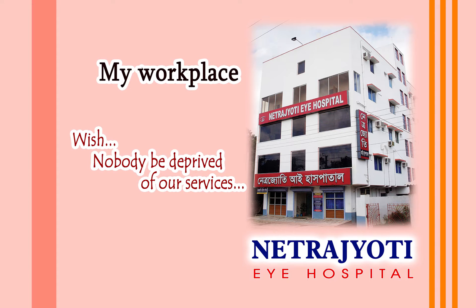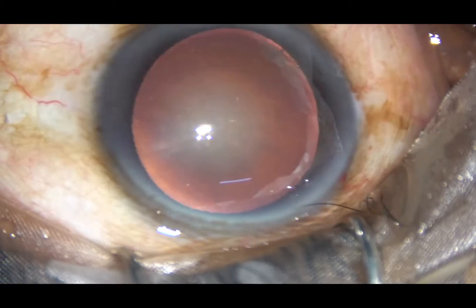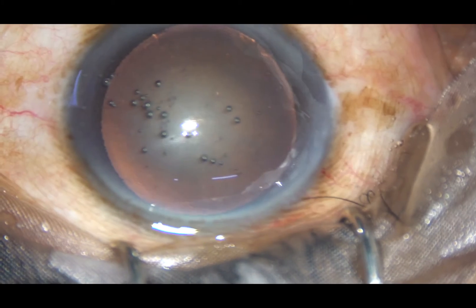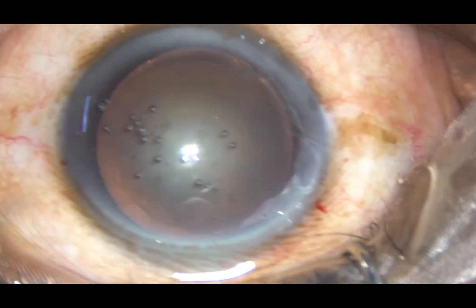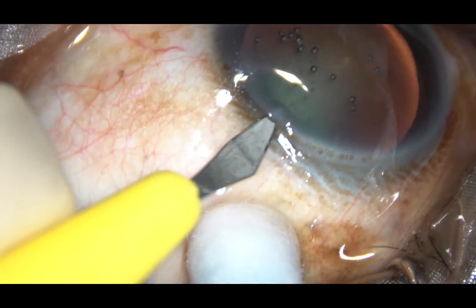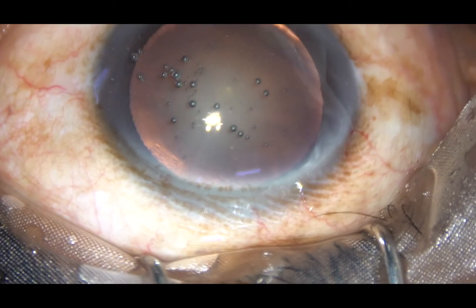Dear colleagues, what I mean by right rhexis is that the size of the rhexis should be such that the periphery of the optic of the intraocular lens is nicely covered all around by the anterior capsular rim. In this case, I have tried to do a right rhexis. The main incision has been made, viscoelastic substance has been injected into the anterior chamber, and there is a side port on the left side of the main incision. I am going to make only one side port in this case.